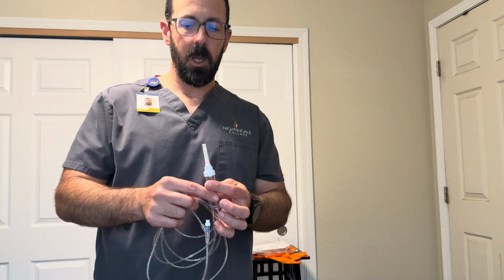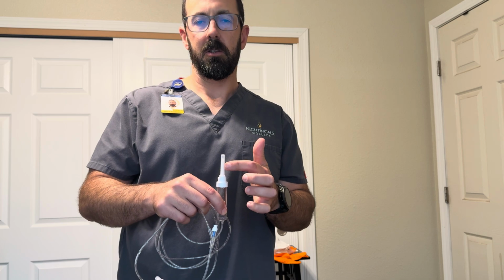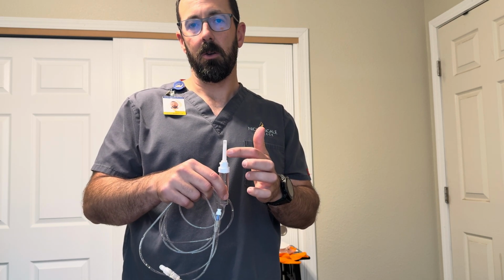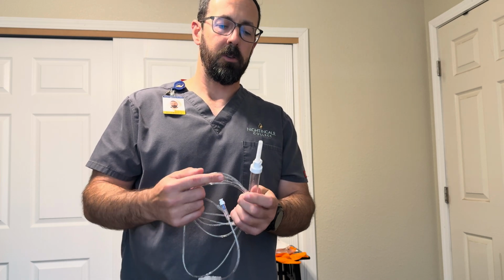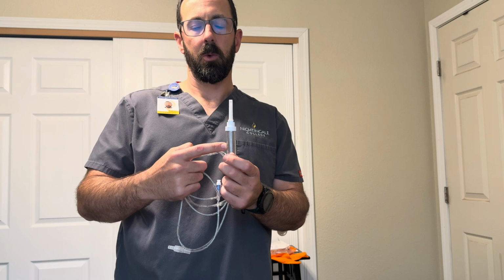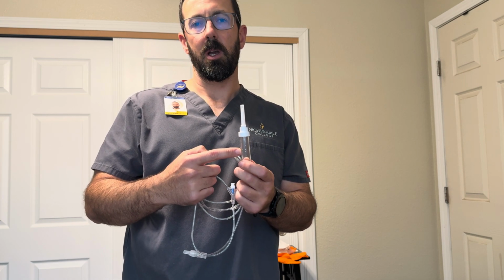identity. So the first portion here is the IV tubing spike. I want to keep this sterile. After that, we have our chamber. This is going to be filled about halfway with fluid. It's also where we're going to be able to visualize our drop rate.